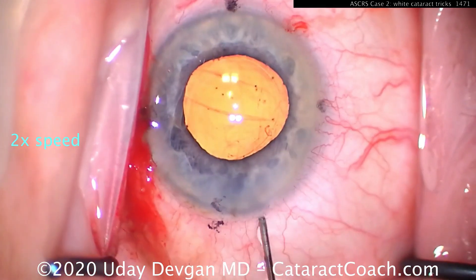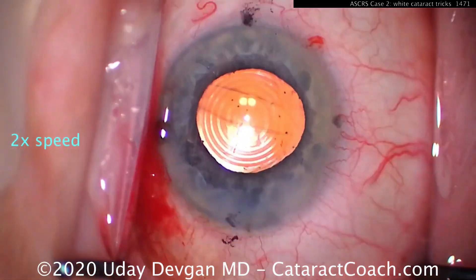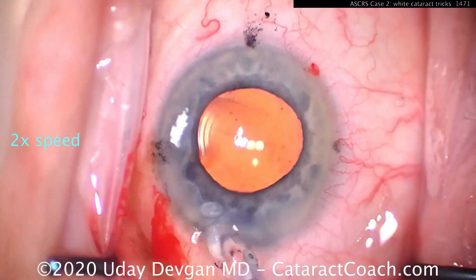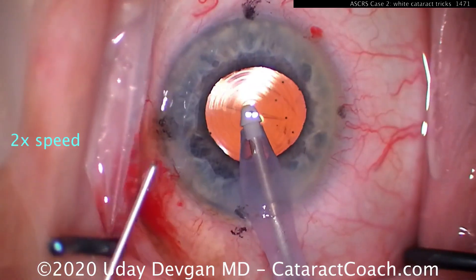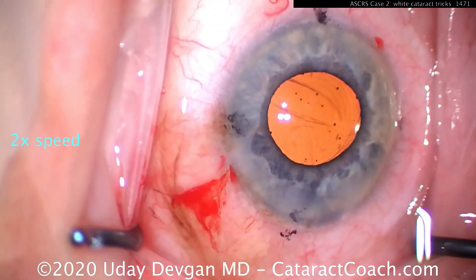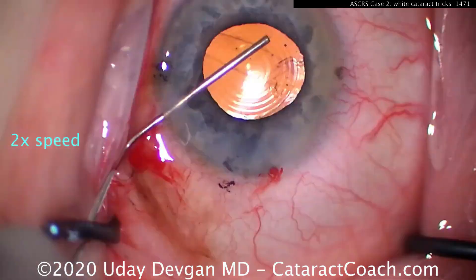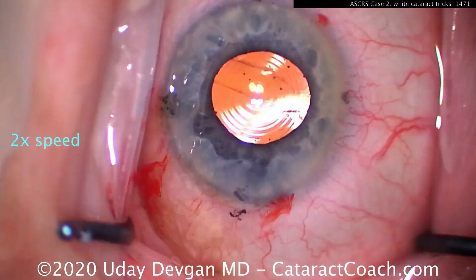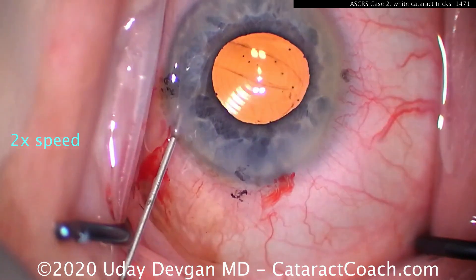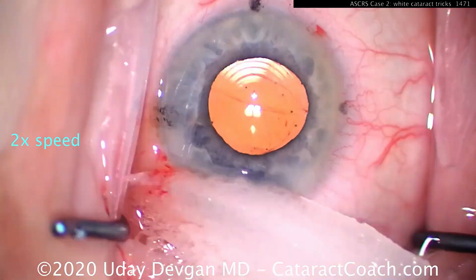Notice: seal up the incision first before removing viscoelastic, because you don't want that AC to collapse at all. Really seal it up. Now remove viscoelastic and lower your settings — drop your flow by 50%, so maybe 20 cc's a minute instead of 40. Lower the infusion pressure by about half also. At the end of the case, don't let the AC collapse. This patient had a beautiful outcome with the lens very well centered and well supported. The capsule will shrink-wrap down and adhere to the remainder of the IOL optic and haptics, and this lens will be stable the rest of the patient's life. There are no undue consequences from this. So try to get the posterior capsulorrhexis done if you have that anterior hyaloid face intact at a posterior capsule break.